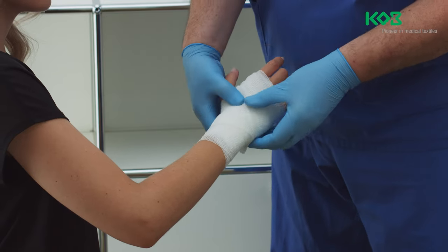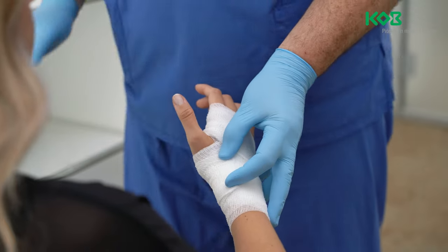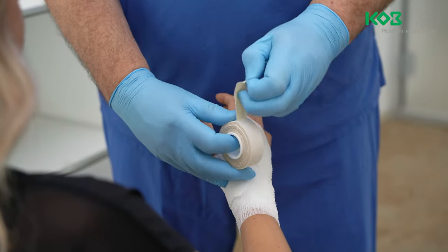Make sure to leave the fingertips uncovered. Once you have covered the entire hand, secure the end of the bandage to the wrist with an adhesive strip.